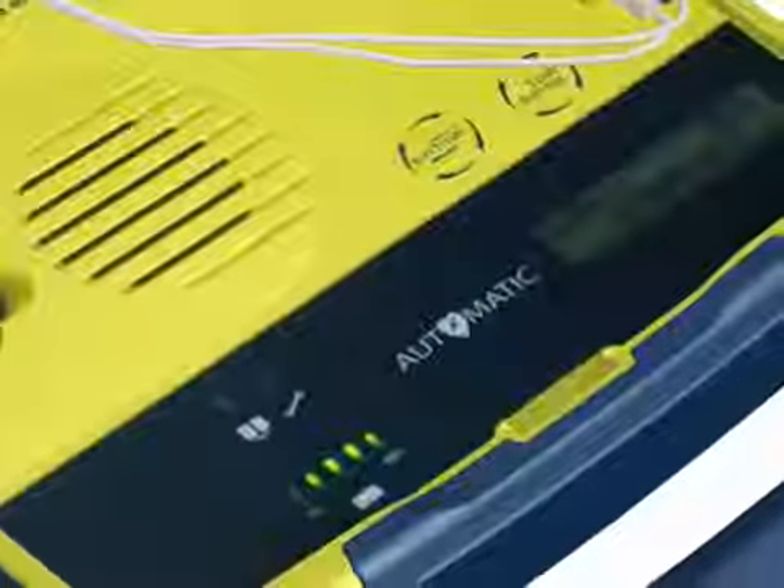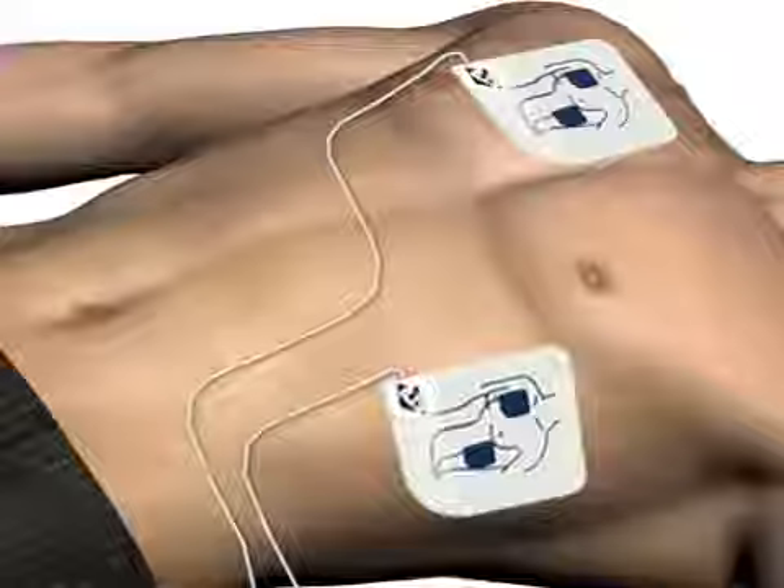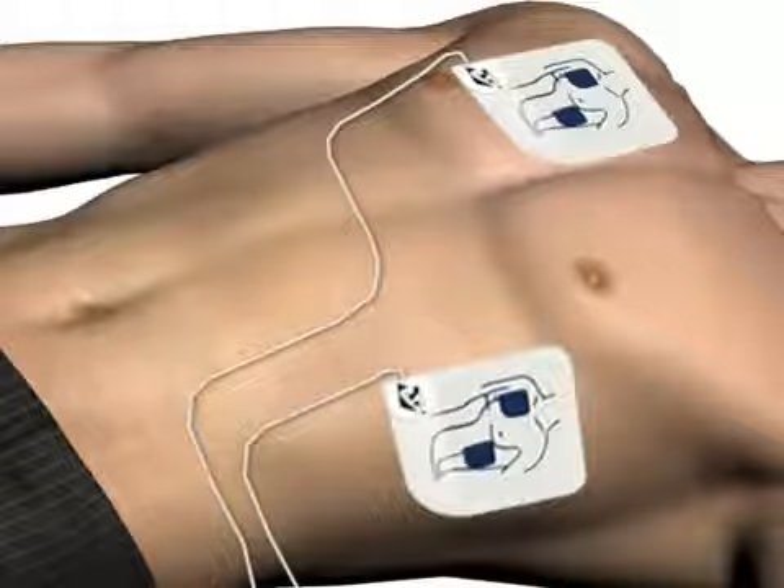the voice prompt will say: Preparing shock. Move away from the patient. Shock will be delivered in 3, 2, 1. Shock delivered.